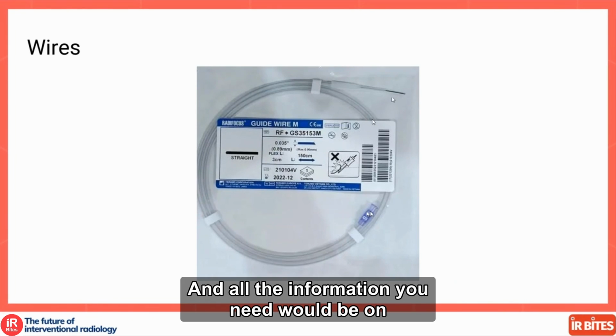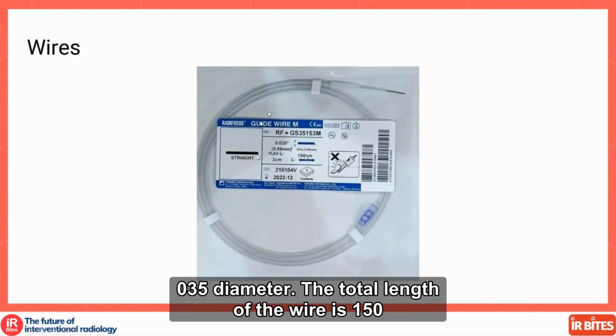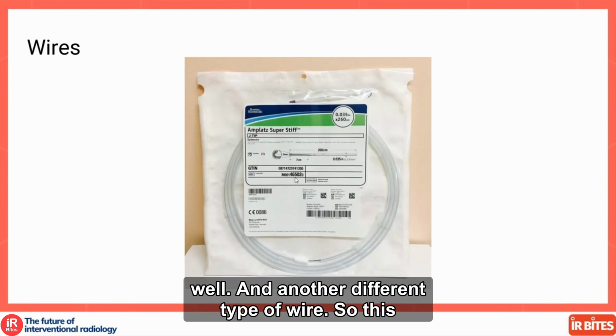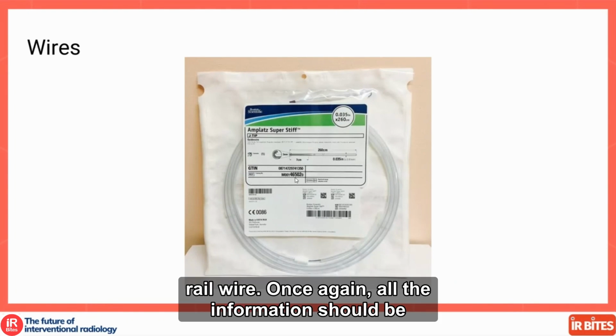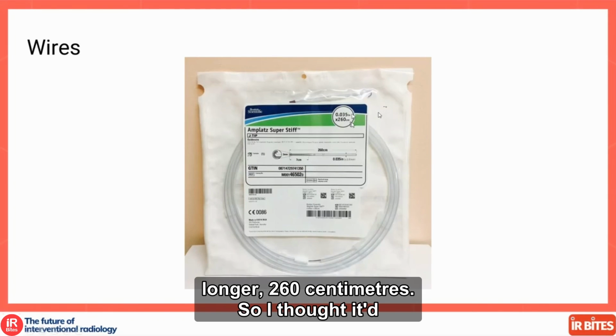All the information you need would be on the packaging as well. So this is a straight wire, 035 diameter. The total length of the wire is 150 centimeters. And always check the expiry date as well. Another different type of wire is this Amplatz super stiff. This is an example of a rail wire. Once again, all the information should be on the packaging. It's 035 diameter, and this is a bit longer, 260 centimeters.